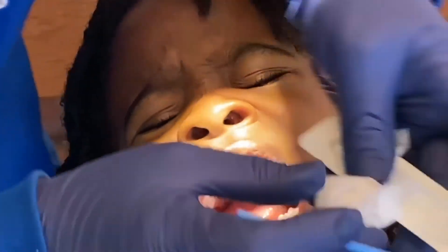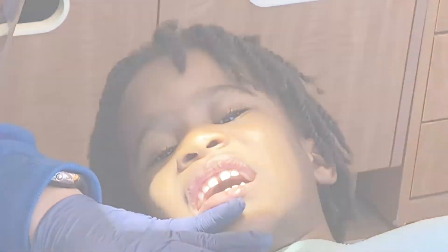Perfect! So wait six hours to brush and nothing crunchy for six hours, okay mom? Keep it close, buddy!